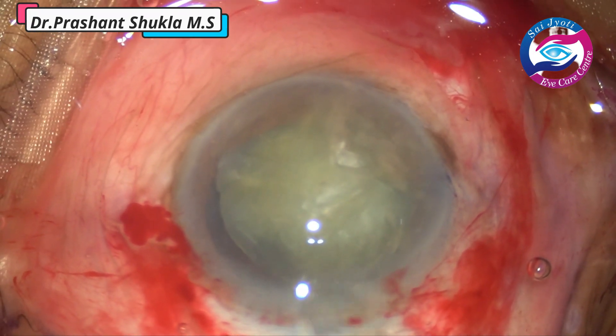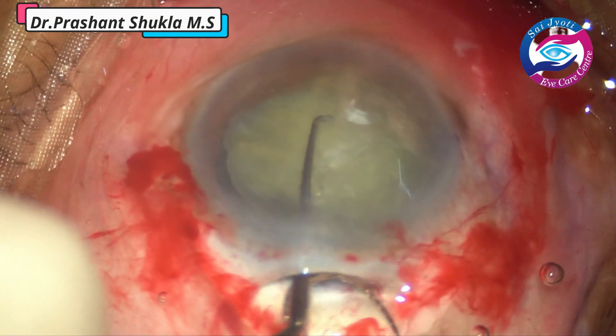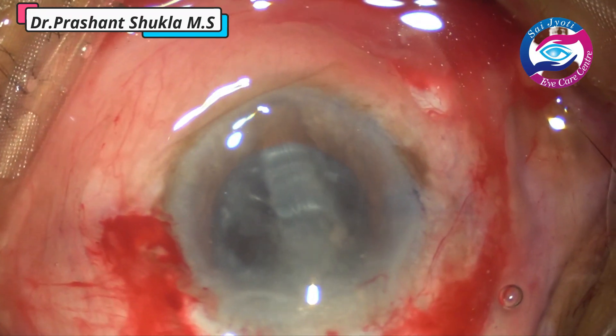The nucleus is already prolapsed into the anterior chamber, and the same phaco sandwich technique is used to remove the nucleus out of the capsular bag.